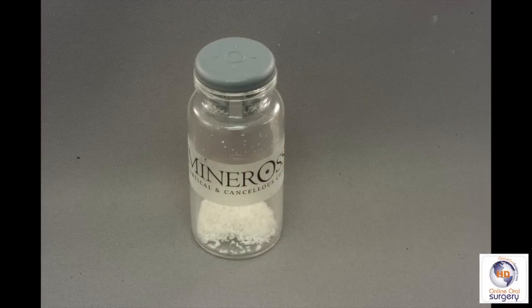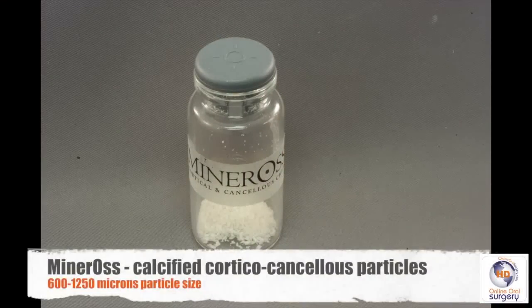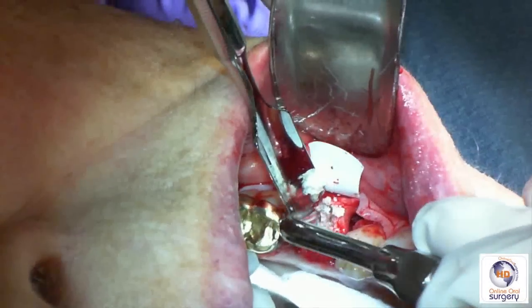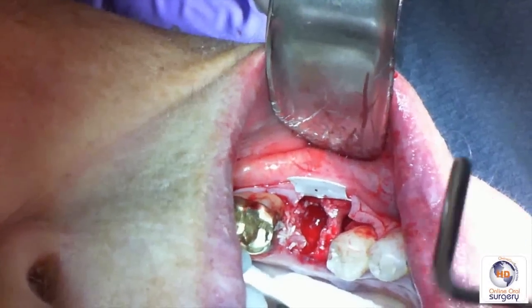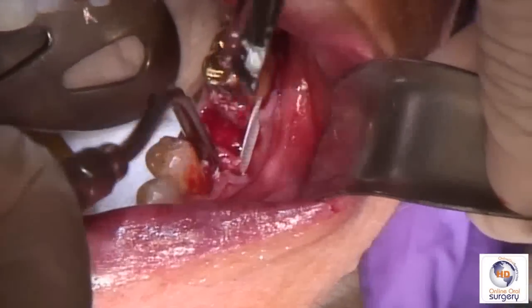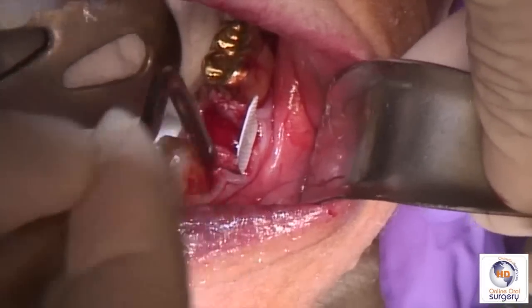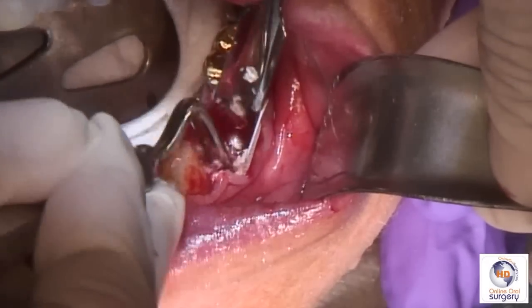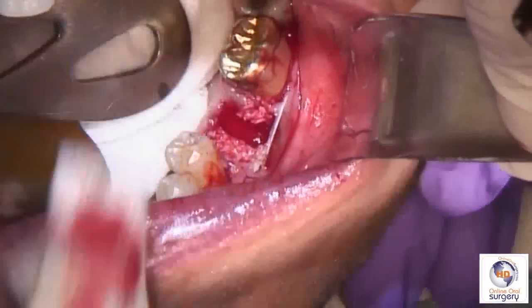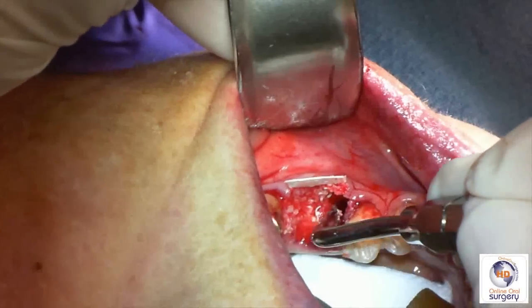My preferred grafting material for this use is Mineros, which is a calcified cortical and cancellous graft with a particle size between 600 and 1200 microns. So now we're going to fill our thoroughly debrided extraction socket with Mineros. If the patient is under IV sedation or general anesthesia, we'll actually draw back some blood and mix it directly with the graft material. In this case, we mixed it with saline because the patient is awake. We want to pack the material into the socket such that there's no dead space within the graft, but it's not overly packed or overly dense.